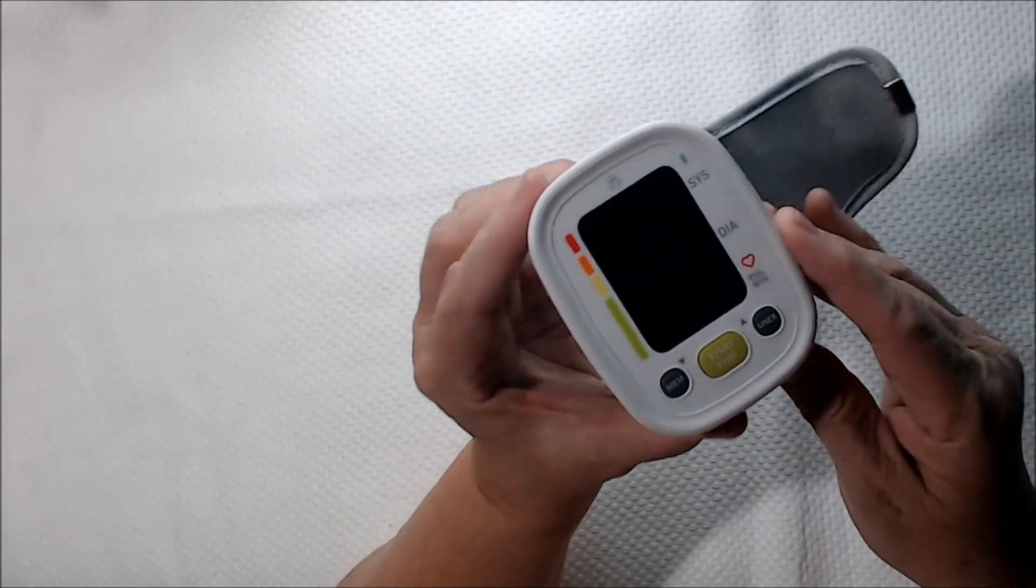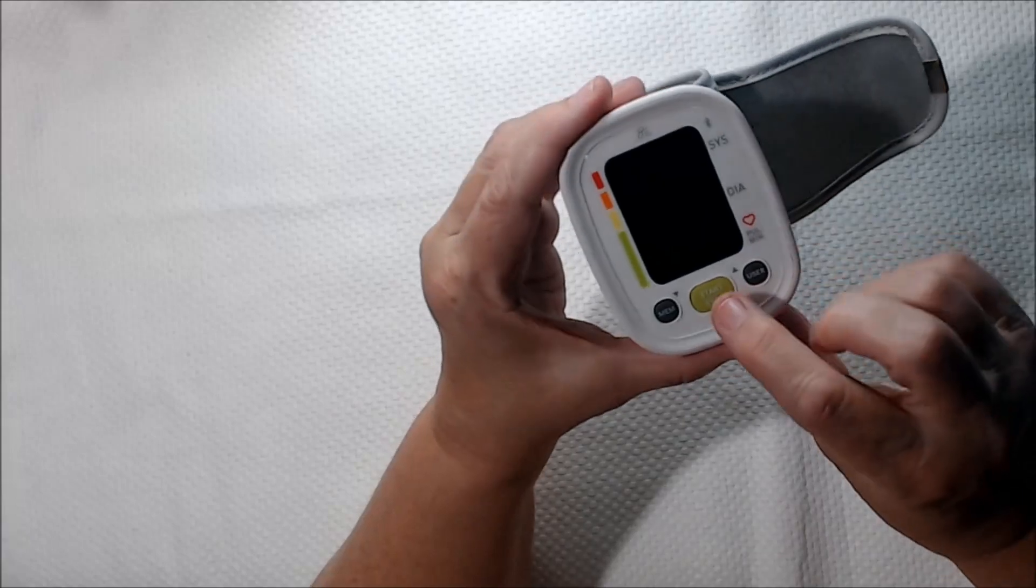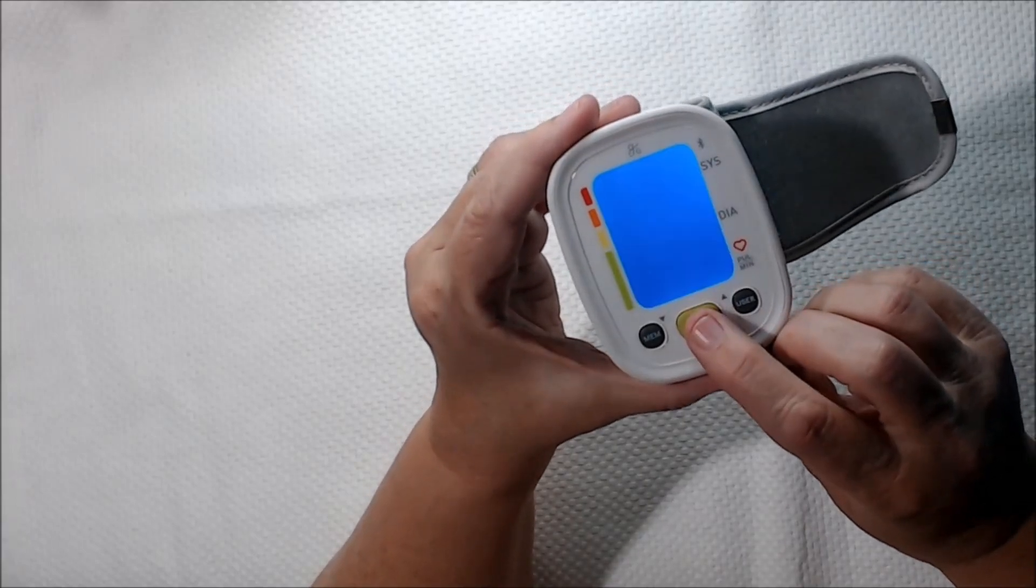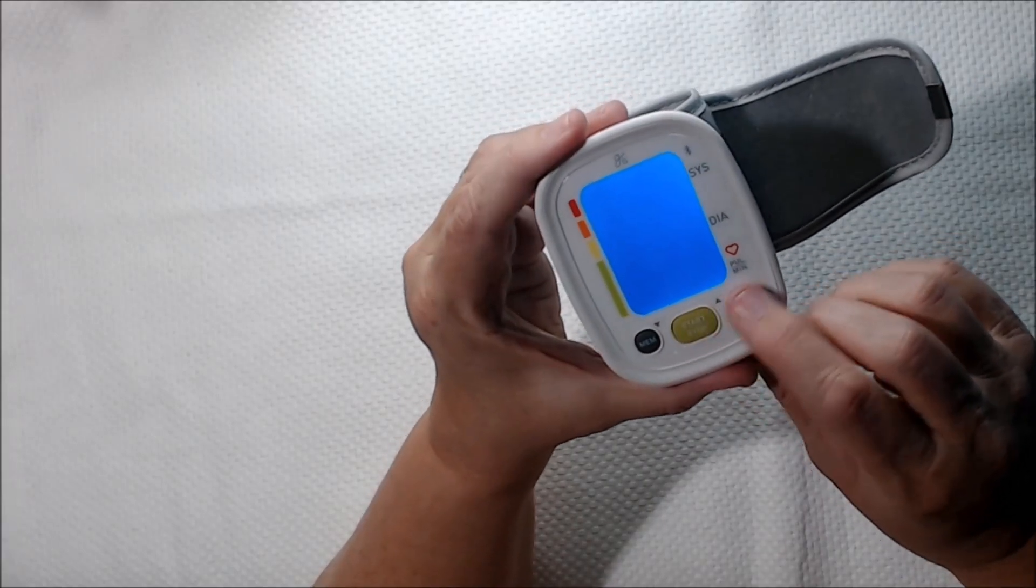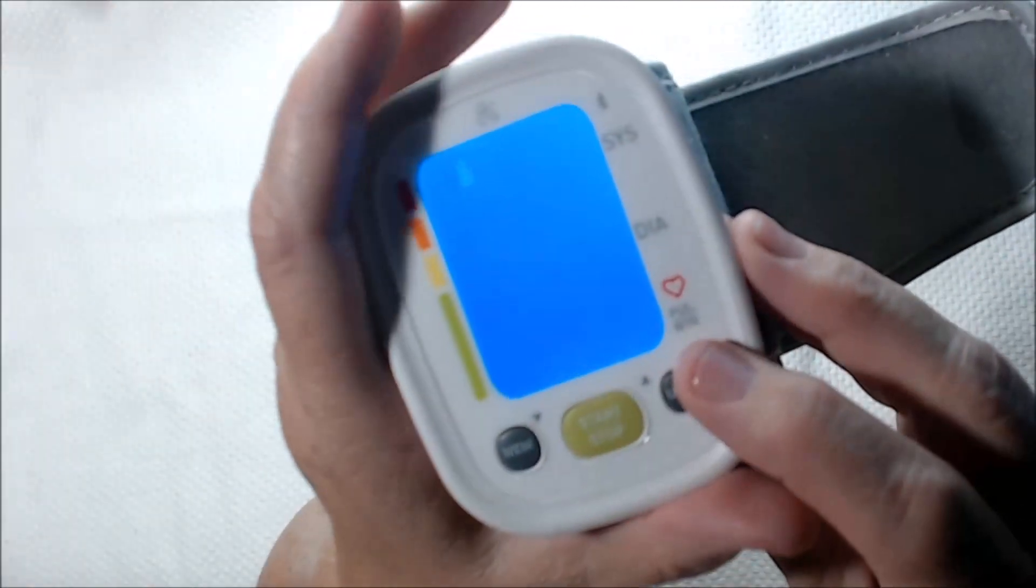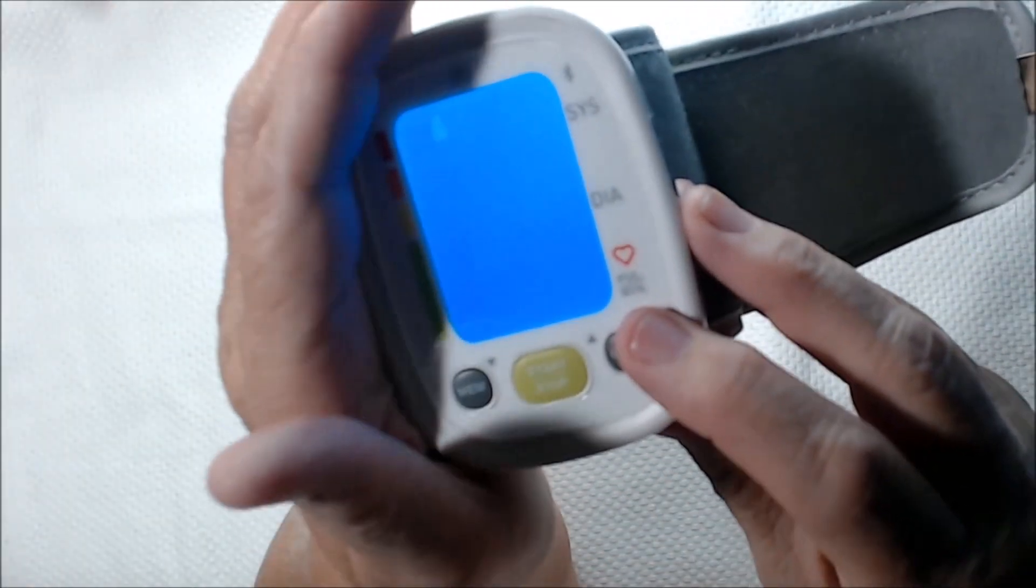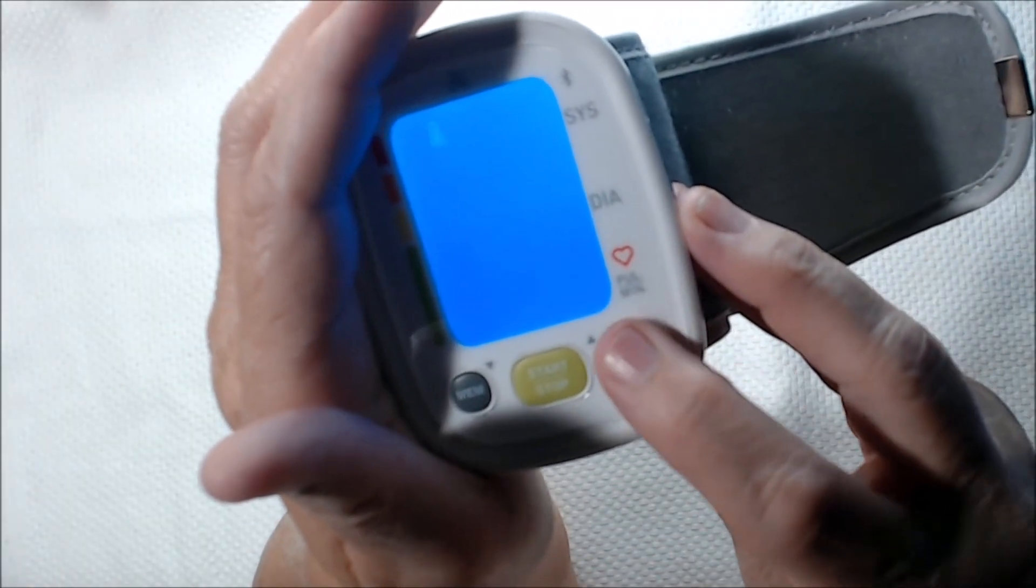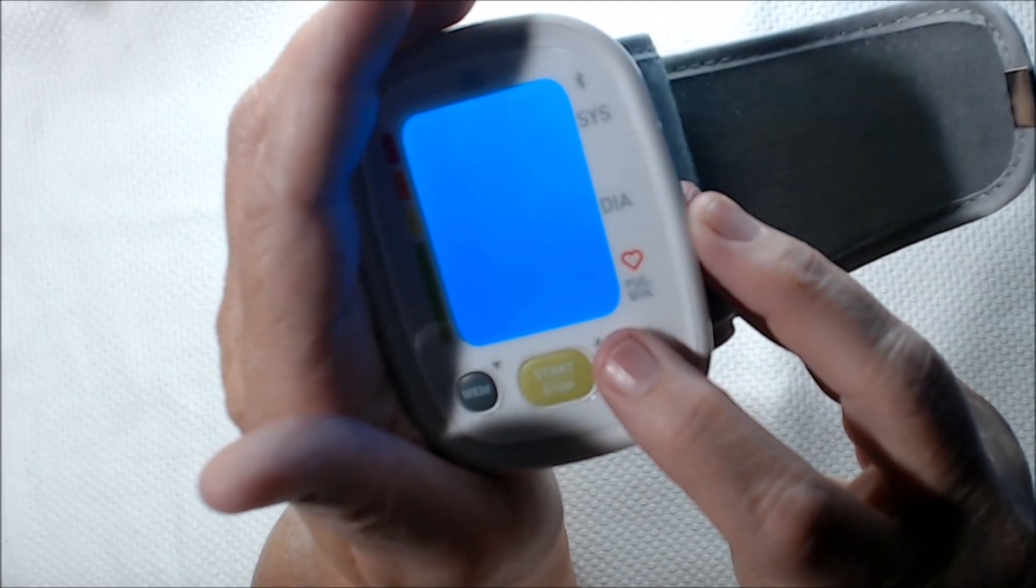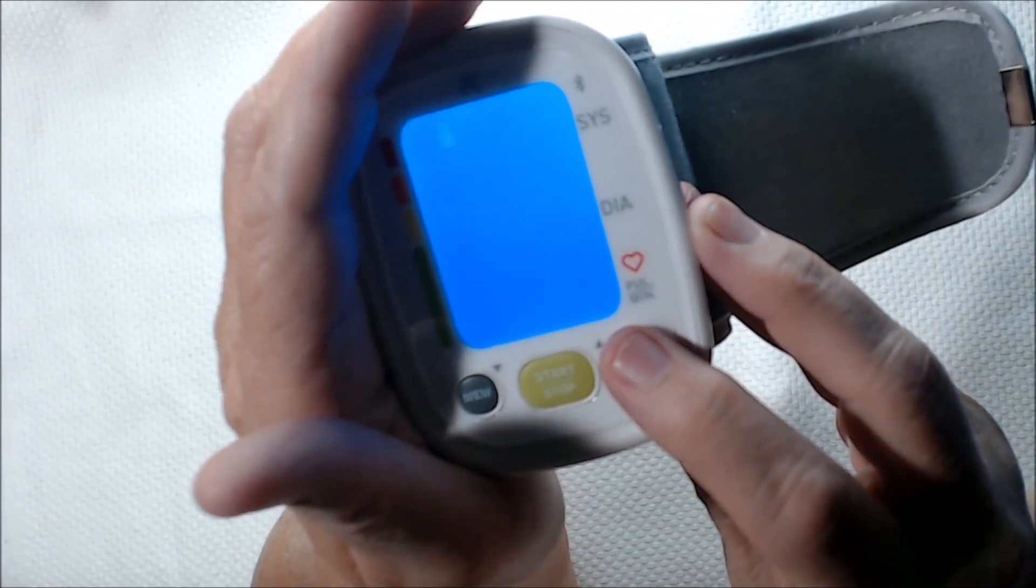It keeps track of up to two people, so between my husband and I, we each have a profile on here. I don't know if you can see it, but it's flashing number two, which is me. You can change to number one, which would be my husband.